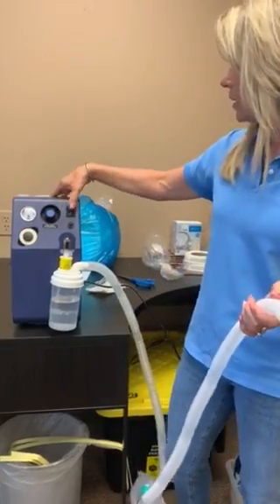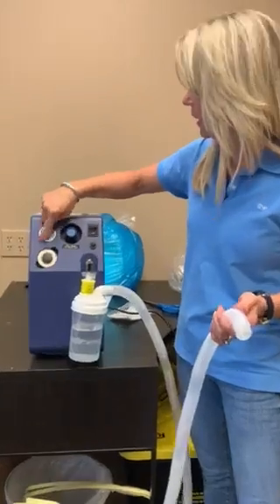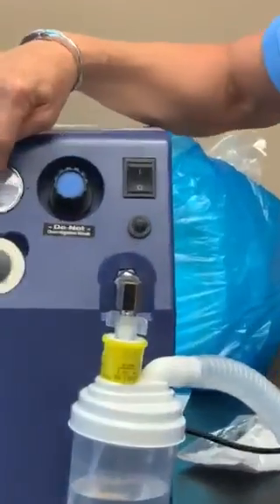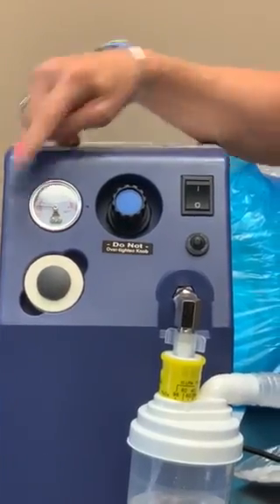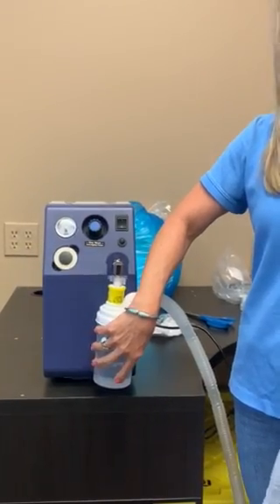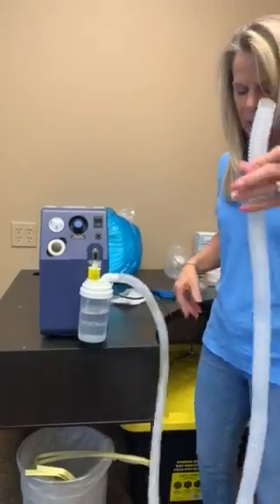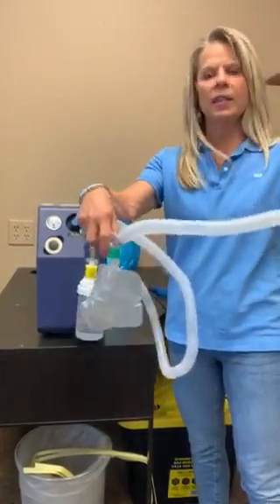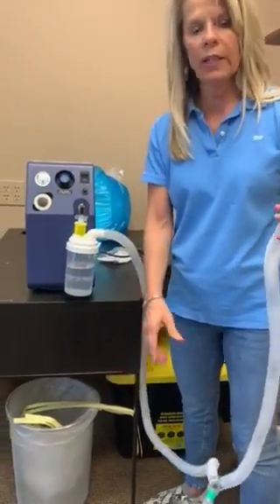So the way this works: this is your power button here. This is the manometer that shows where we set it, between 25 and 35. This is your water bottle — we always use distilled water here and you fill as needed. You have the corrugated tubing and you have the drainage bag, which hangs down at the low point and helps the water drain into the bag.